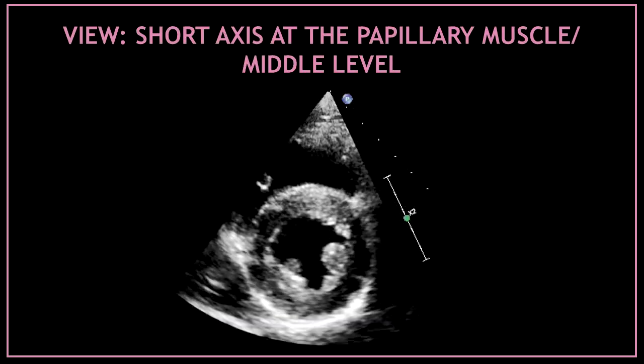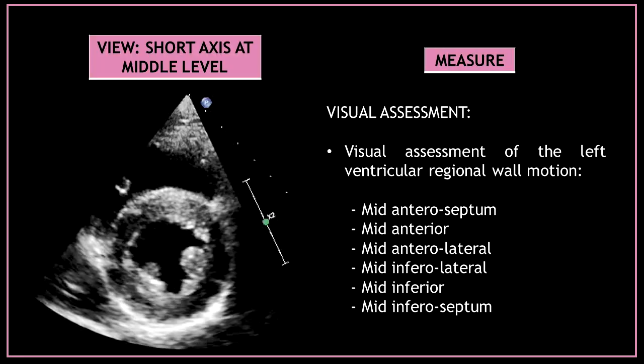Now let's move to the parasternal short axis view at the papillary muscle or middle level. Obtain this view and do a visual assessment of the left ventricular regional wall motion. In this view we can only see the middle segments of different left ventricular walls, so assess for any regional wall motion abnormalities of the mid-anteroseptal, mid-anterior, mid-anterolateral, mid-inferolateral, mid-inferior, and mid-inferoseptal segments.